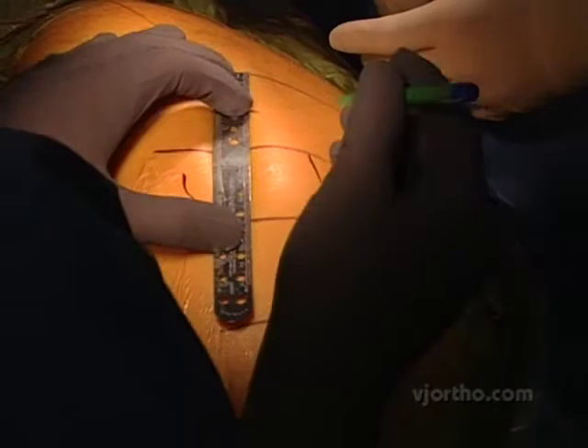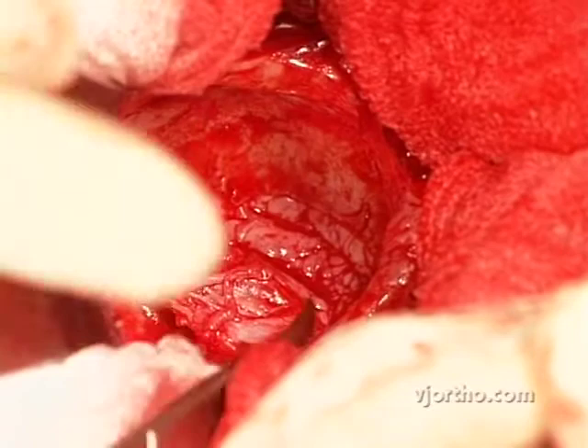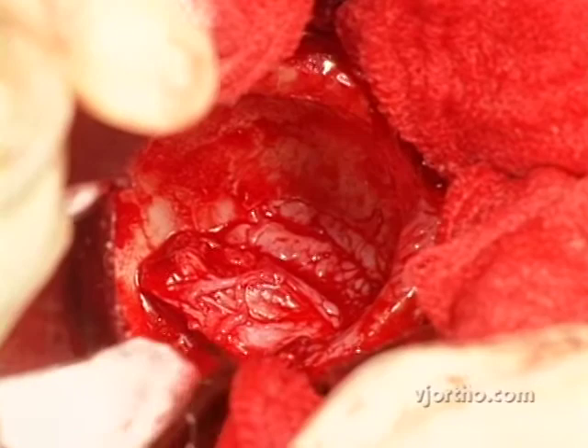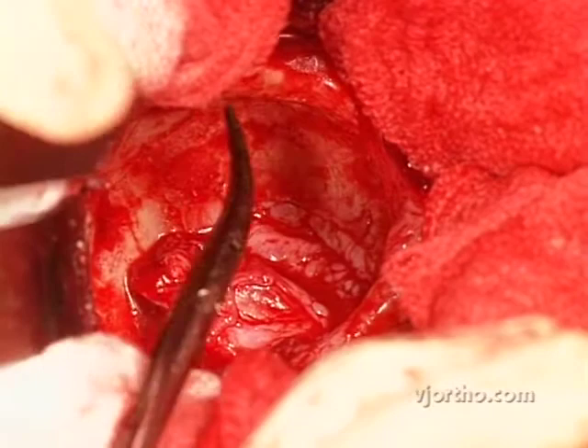The method of exposure Dr. Murphy has chosen for today's patient is a modified direct lateral approach similar to that described by Dr. Hugh Chandler. What you can see now with an anterior superior retractor, a Blunt-Hohmann retractor and the lesser sciatic notch pulling the femur posteriorly, and a Cobra retractor just deep to the rectus tendon anteriorly — it gives you the entire acetabular exposure with anterior labrum here, superior labrum here, and posterior labrum here.